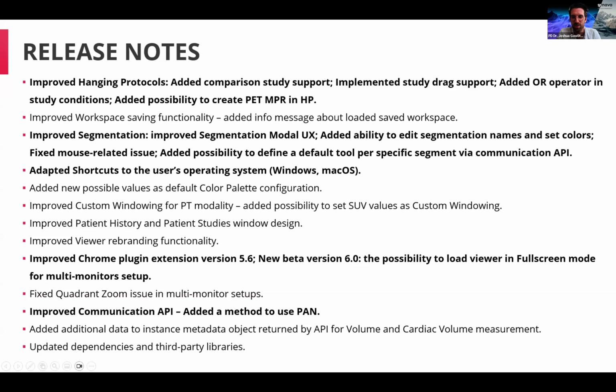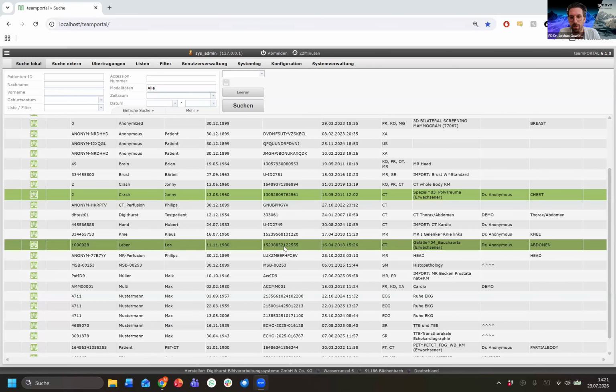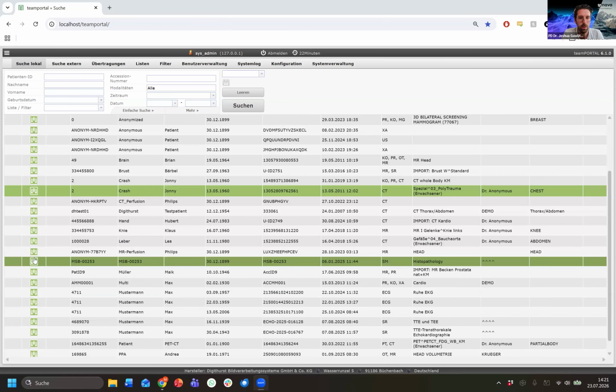Awesome, Raimundas. Thank you so much. Basically, we will not go into every technical detail that Raimundas talked about and watch everything, because I think it's most interesting for you to see what your customers will finally do with it. And I think there are small, really, really nice changes, or from a technical perspective, even major changes that make it really smooth now to work with the MedDream.